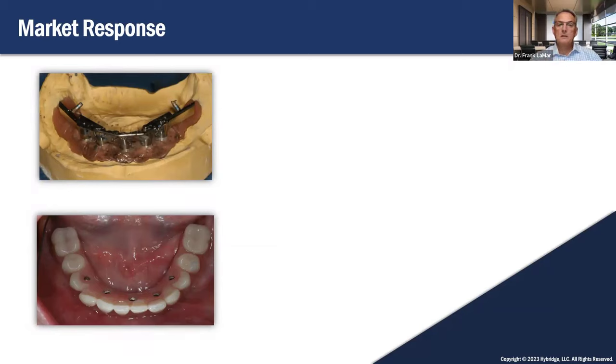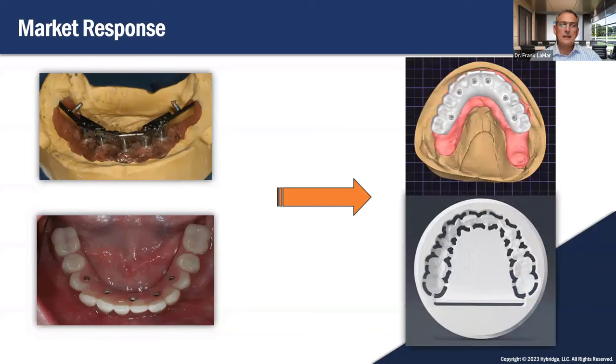So a lot of the market transitioned in one fell swoop over to zirconia. And monolithic zirconia restorations, there was the Prettau material probably 15 years ago, and it was all the rage. I have to say that we did jump in a little bit on that. We still actually have zirconia in our laboratory, and probably 2% of our restorations are ordered as zirconia. But most people find these restorations very challenging.